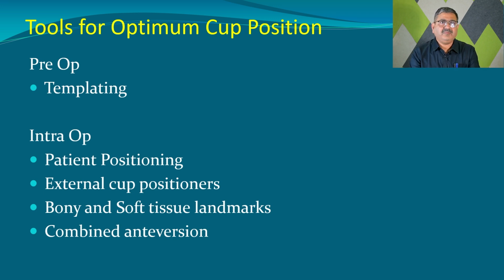So how to achieve this? The main thing is pre-op templating. You must have pre-op planning. Intra-op, nowadays most joint replacement surgeons depend on intra-op parameters rather than pre-op templating, because there are a few problems with templating. So the main consistent factors are intra-op.